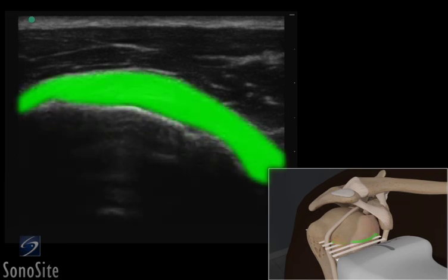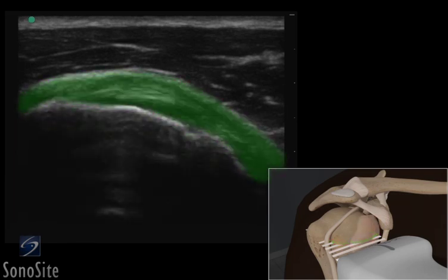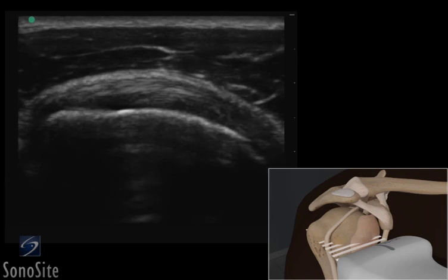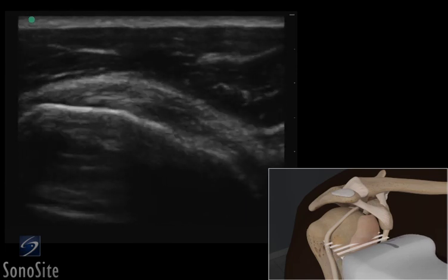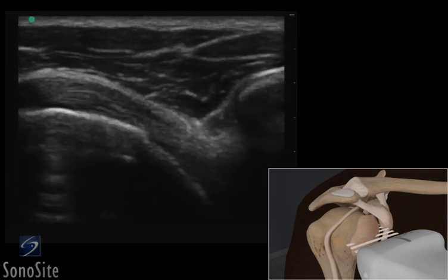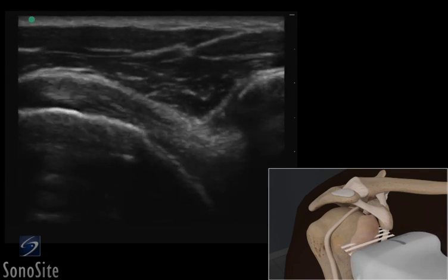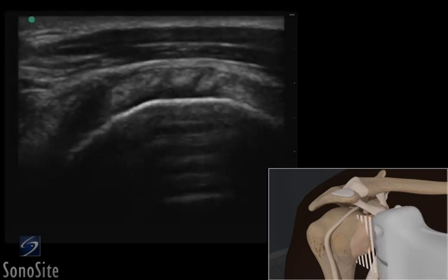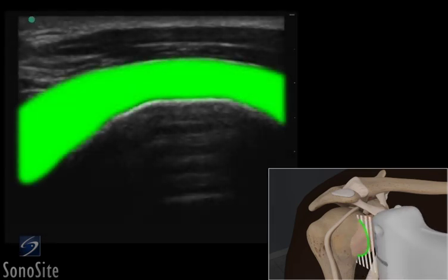The subscapularis tendon should be evaluated by sweeping the transducer from its proximal musculotendinous insertion on the lesser tuberosity to the inferior portion. The examiner can provide gentle resistance against the subject's arm during internal rotation to highlight subtle pathology. The transducer is then rotated 90 degrees clockwise to evaluate the subscapularis tendon with a short axis view.